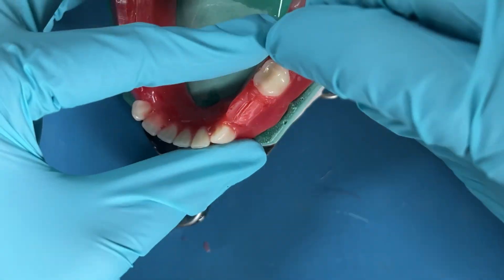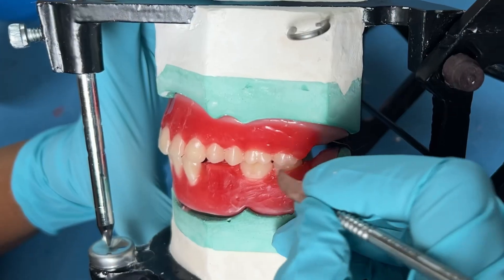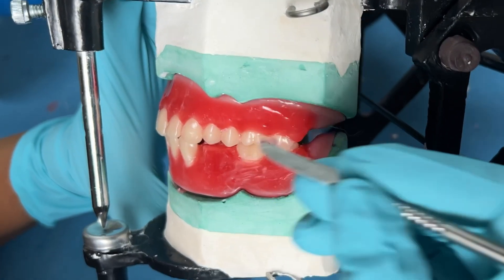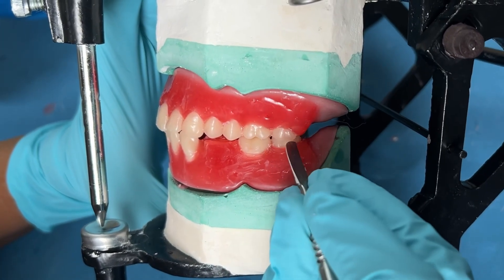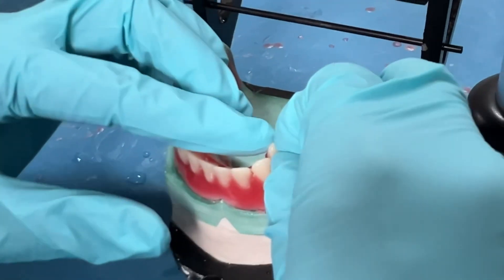The second molar is set in a similar manner. If you have got the key of occlusion correct, then automatically the rest of the mandibular teeth will align perfectly. Move on to setting the mandibular first and second premolars.